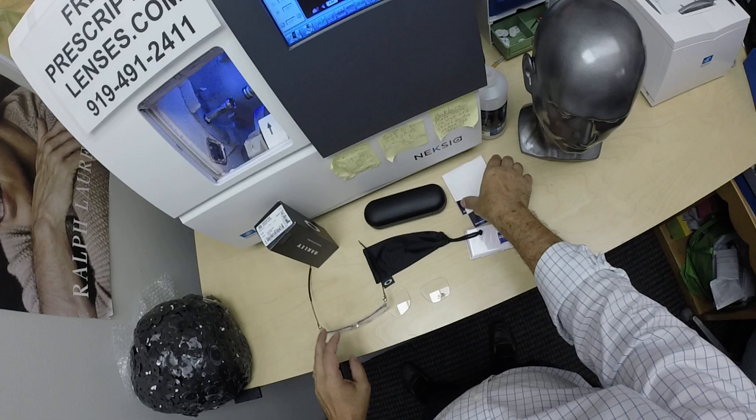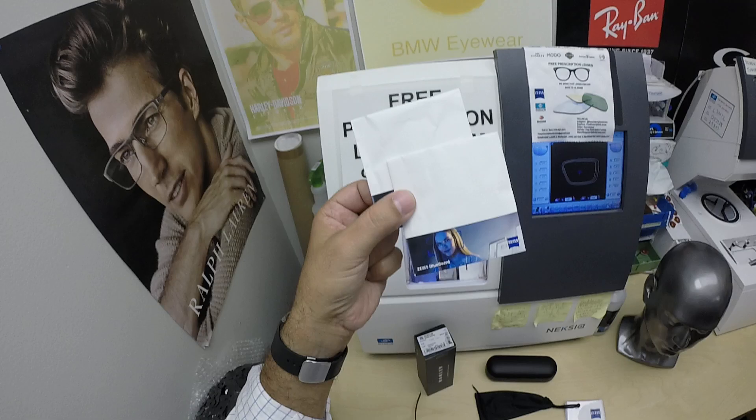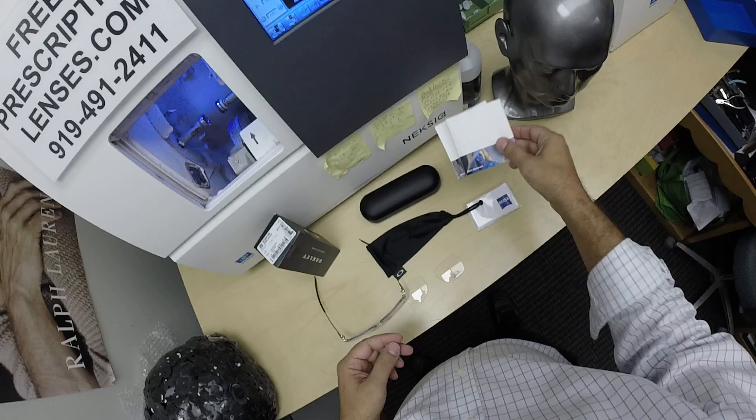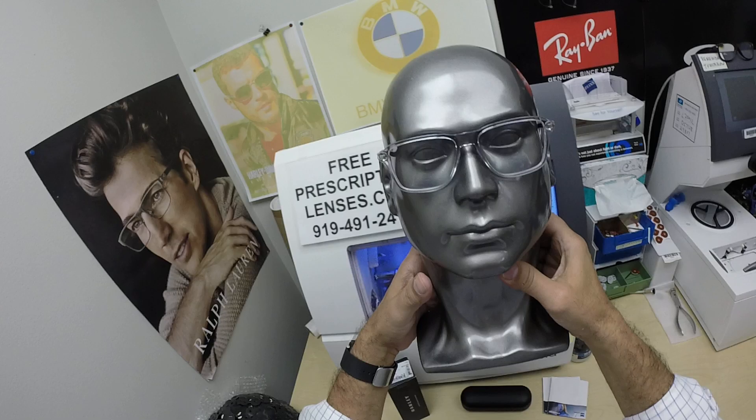He got the Zeiss Photofusion Extra Gray Enduravision Platinum Anti-Glare. Usually about once a month, whoever's running the sticker inker thing at Zeiss — that is a very technical term, by the way, that is a real job title — they forgot to put the sticker on his lens packet. Sorry about that, but you do get the Zeiss cleaning cloth and the real Zeiss lenses. It's just they didn't tell you that. But this is what it looks like.